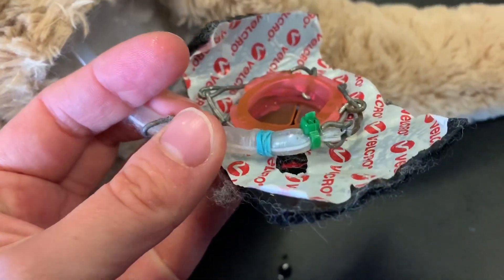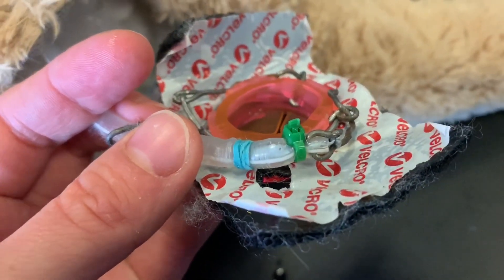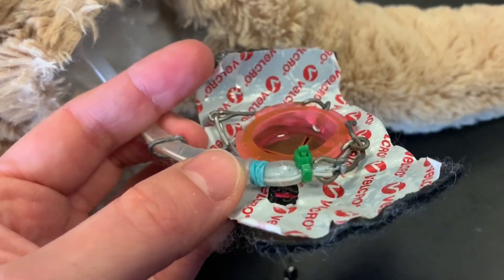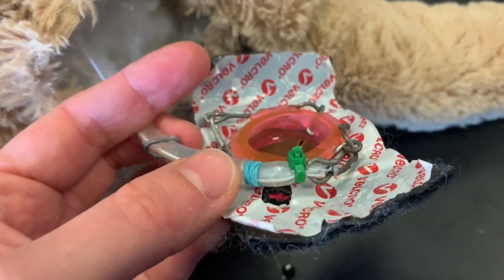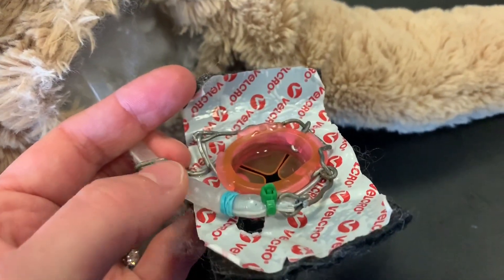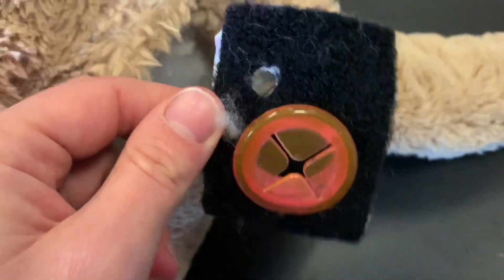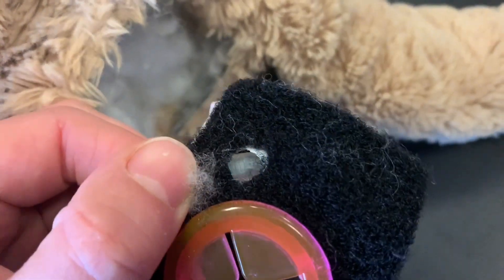Behind that, you can see an elastic band — one of the loom bands that children use to make bracelets. The loom band is what functions as a pressure valve, so when you fill the bulb and apply pressure from the base up, it will express above that band, which correlates to the hole through the Velcro on the other side.